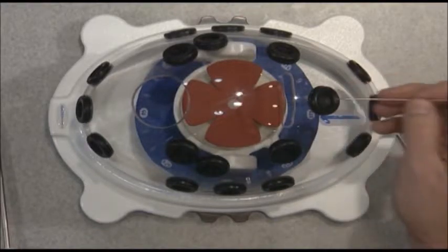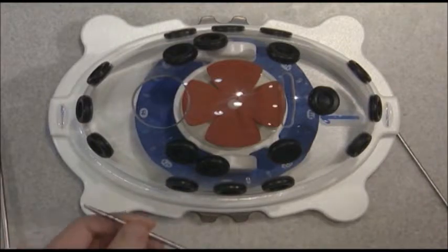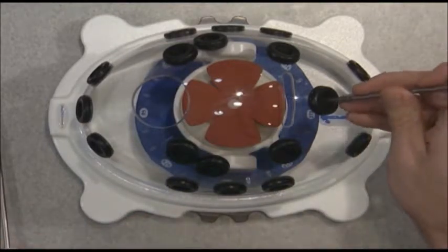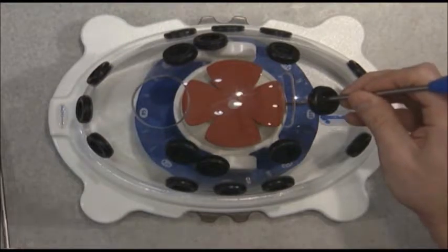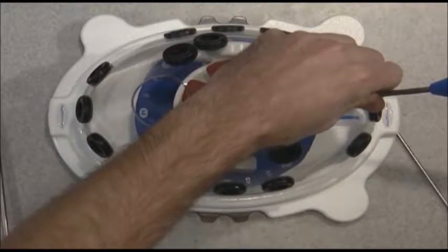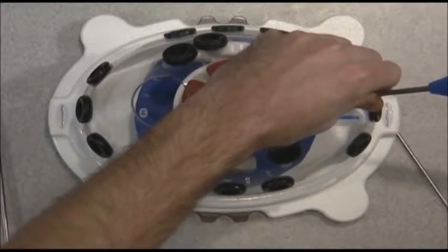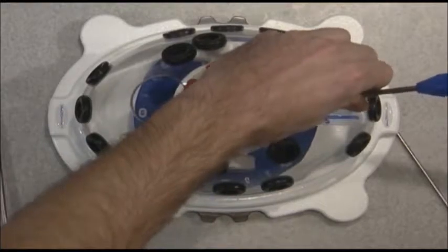After you've triangulated with the spinal needle, the anchor that I'm using requires a punch. And so we're going to take a little punch and find a spot that's about a 45-degree angle and mallet the punch in.